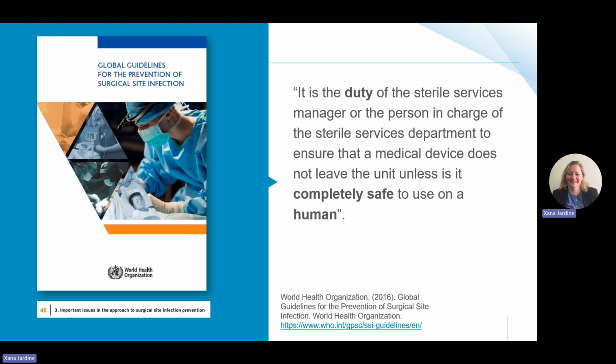This line from the World Health Organization's Global Guidelines for the Prevention of Surgical Site Infection is one that resonates with me. It's the duty of the sterile services manager or the person in charge of the sterile services department to ensure that a medical device does not leave the unit unless it is completely safe to use on a human. Very important, and I think everybody in CSSD takes that role seriously. But now, if you're doing this process in the anteroom, the item's never leaving your theatre. It's going somewhere to the anteroom, the scrub room, the basin, the corner, and then into a flash or immediate use steam sterilization process. There's no CSSD supervisor who's taking control here, and it is you.